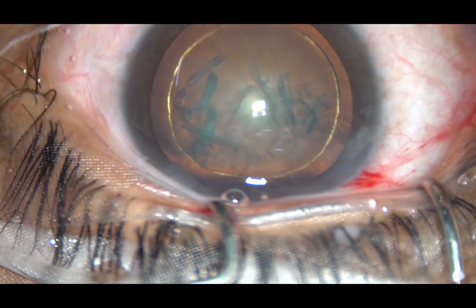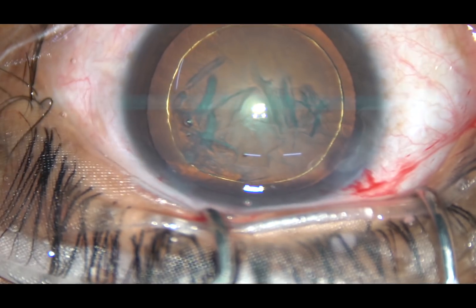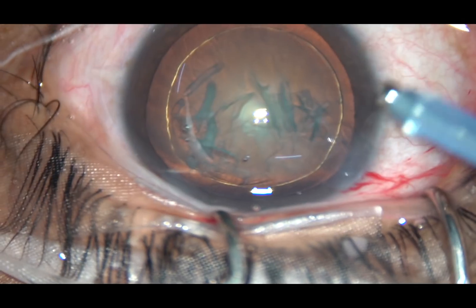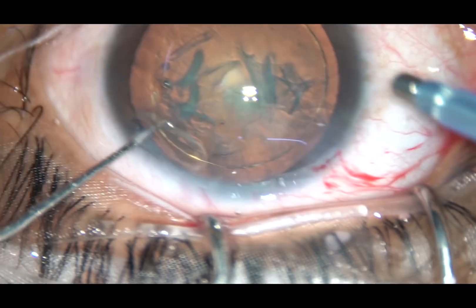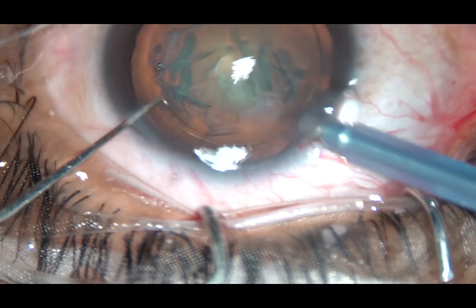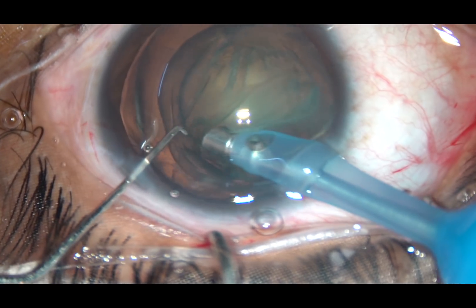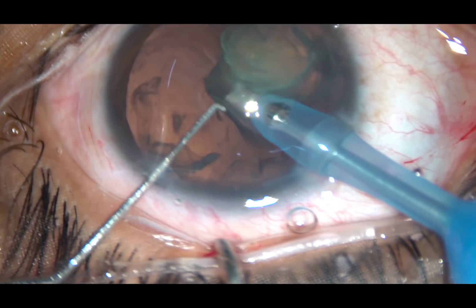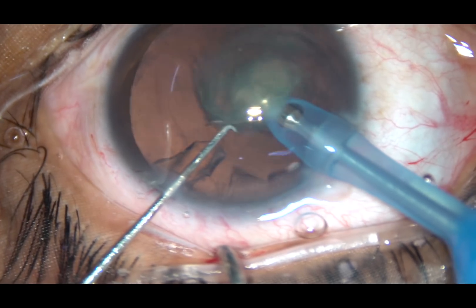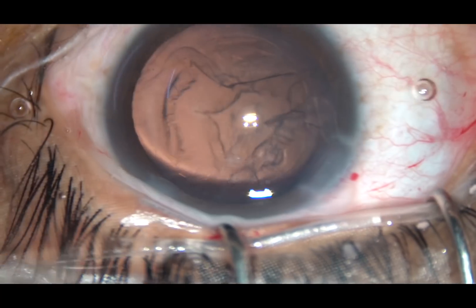By this time, hydrodissection and hydrodelineation have been done. Now see how the carousel or cartwheel technique is being performed. The tip of the phaco handpiece is introduced, the bevel faces the nuclear mass, and the bevel is at the junction of the nucleus and epinucleus. See how beautifully the whole nucleus rotates — it gets emulsified and is removed in no time.